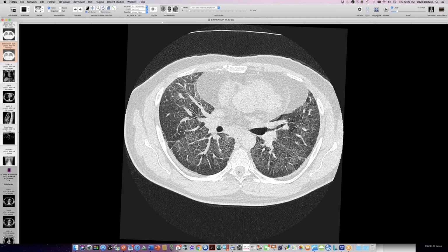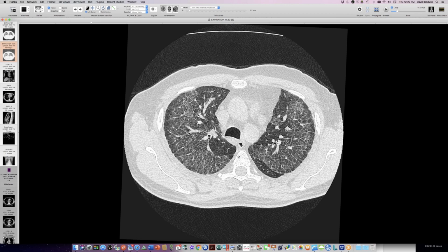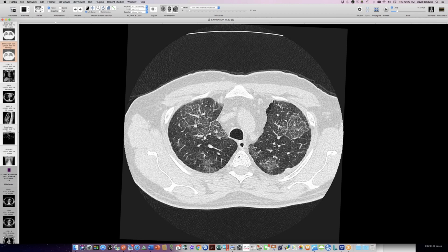But so, Jeff, I remember some cases of lymphangiectasia that you showed. That's why I inquired about that yesterday, and you sent some cases. They were similar to this pattern with ground glass and septal lines. They were patchy. There wasn't as much of this as before. He's had lavage. There was nothing remarkable on that. He did not get transbronchial biopsy. He's scheduled for axillary lymph node biopsy next week. And if that's not revealing, then he'll probably get EBUS and sampling of that subcarinal lymph node. So we'll see if this is all being driven by his lymphadenopathy.